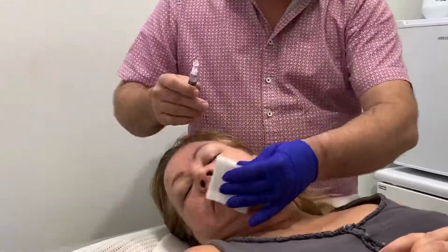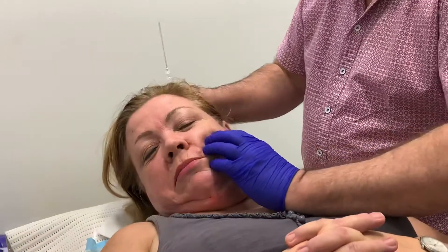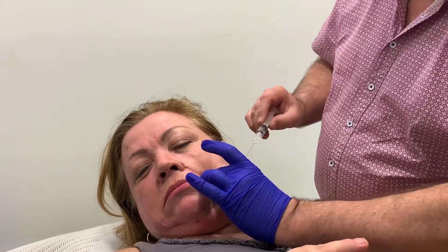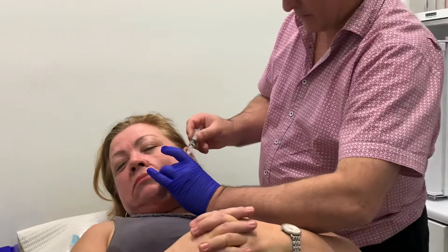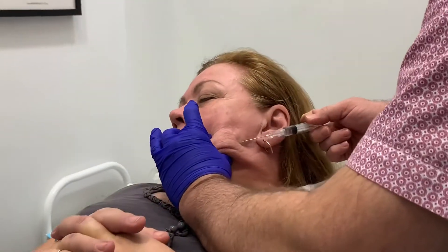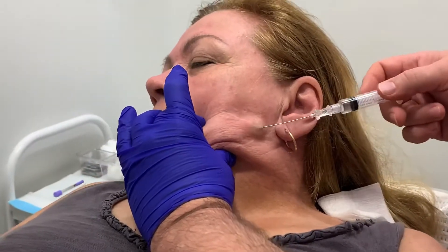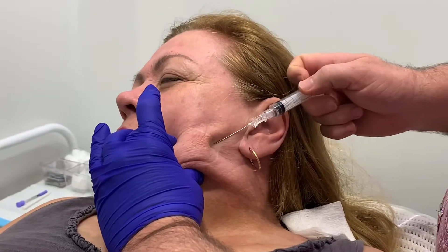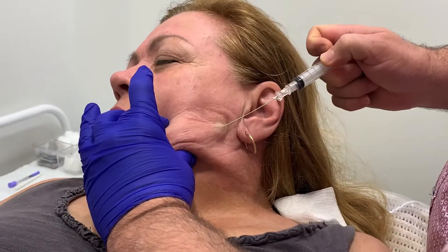Okay, let's roll onto the other side. We're doing the same scenario. Just lift up for me a bit so I can feel the tissue. There it is — I can feel where I want to go. Do you find any difference between this needle and the one in your chin? About the same — one is not more pain. No.